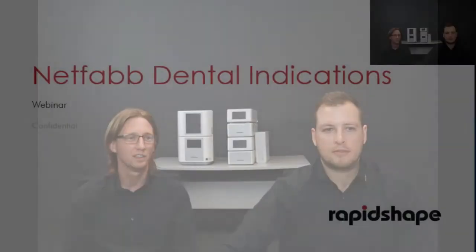Welcome to our next webinar. This is webinar number 3. We are talking today about the different dental indications in NetFab and how to prepare them in your workflow.